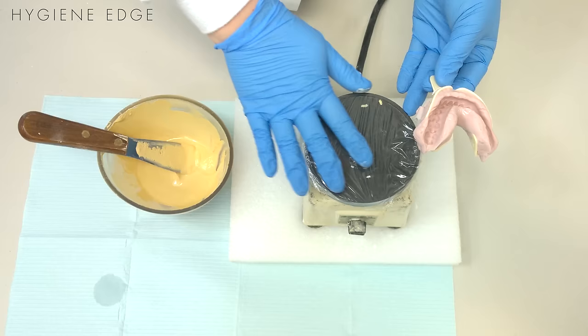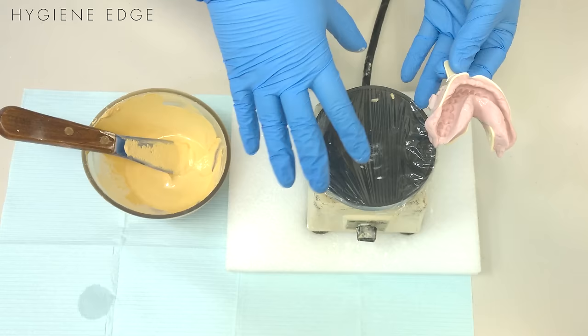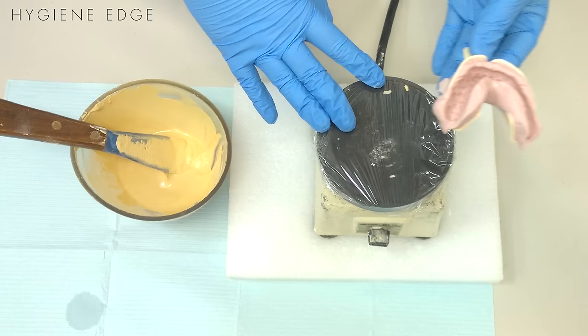To pour up an impression, the first thing you want to make sure to do is cover your vibrator in something—either a bag, saran wrap, or tin foil—anything to prevent the stone from drying and caking on there as you pour up your impression, because you'll notice it is a little bit of a messy process.